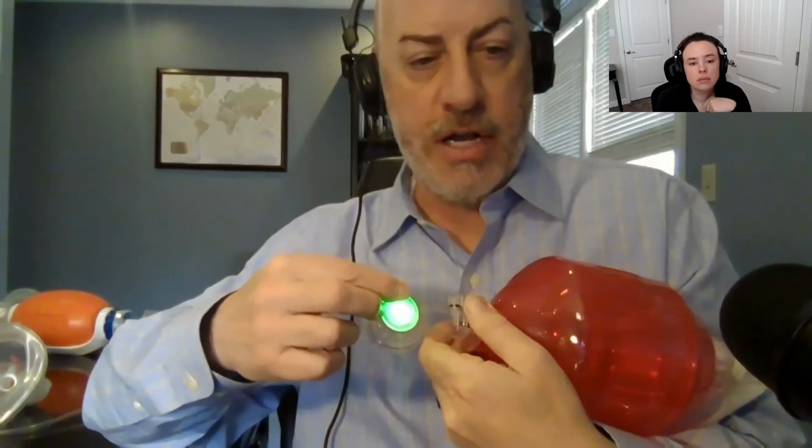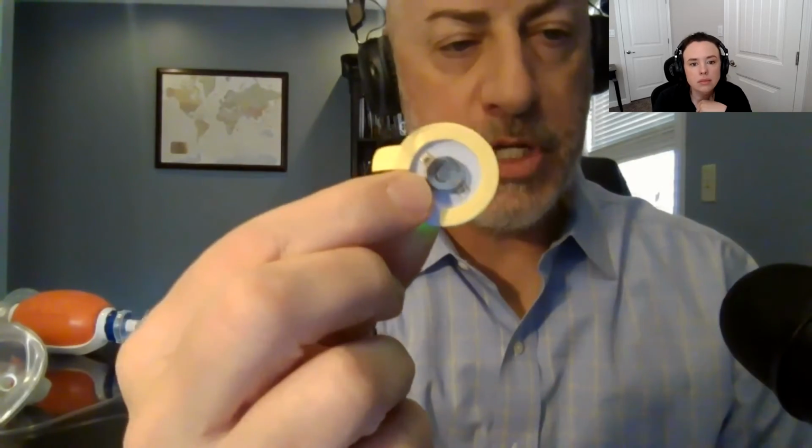They make a pediatric one that is 20 times a minute. The company that makes that is the same company that makes this BVM, and you can buy it with the timing light already on, or you can just buy the timing light and there's a sticker in the back, and you can just peel that and stick it to your existing BVM. Well, you don't even have to put it on your BVM. Put it next to the patient anywhere where you can see the light blinking.